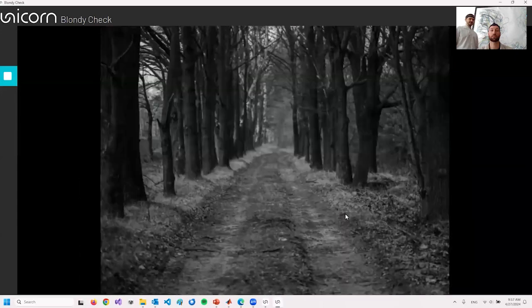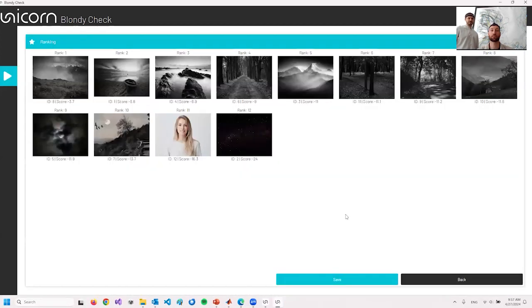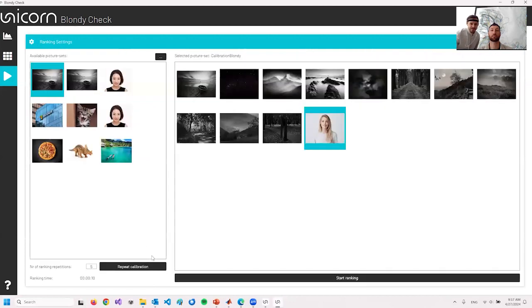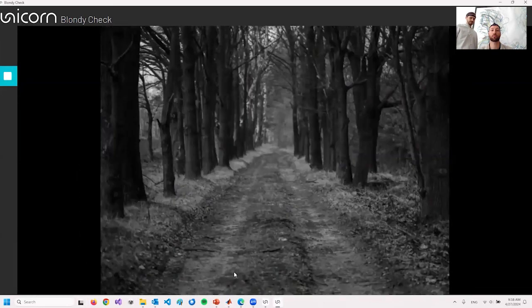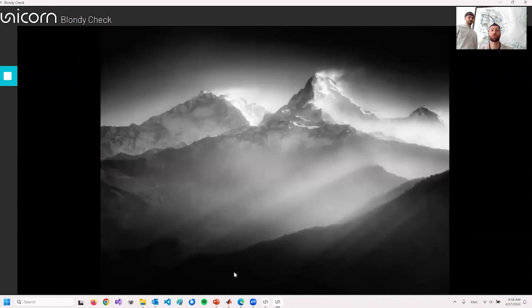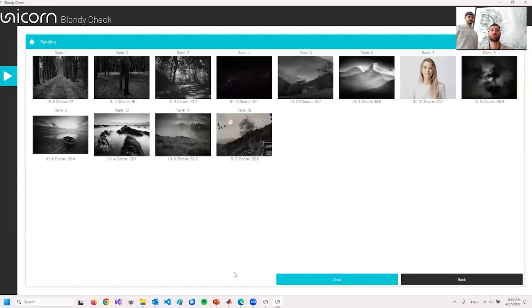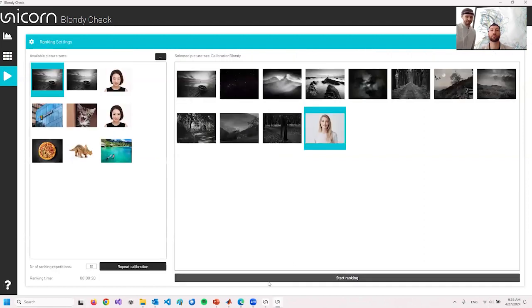Leo is looking again just at the screen, and we can see if the blonde lady is ranked in first place as we would estimate. Not really right now. If it's not working, you would either increase the number of repetitions or redo the training and see if the system is fitting. We wait again to have some good signals, and we can start again. It's closer to the front, and we'd have to repeat the training to get a better classifier.